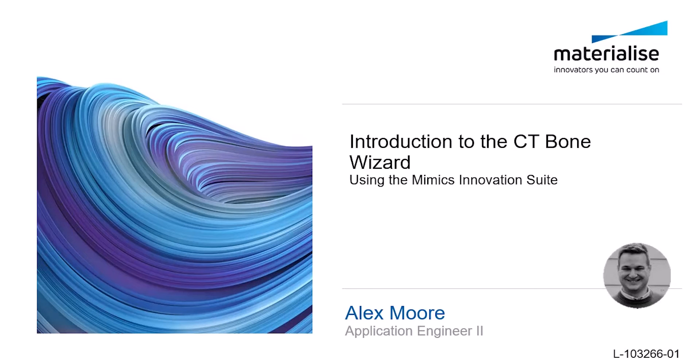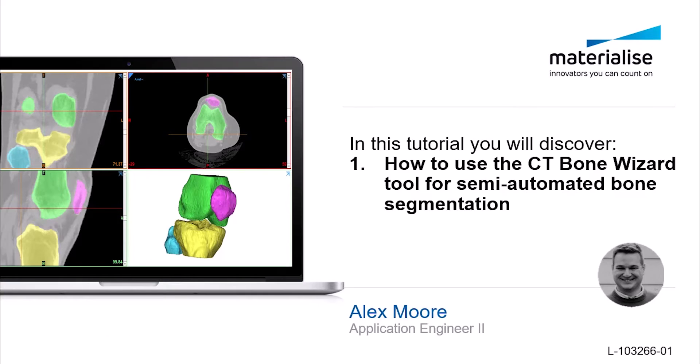Hi, my name is Alex Moore, and I'm an application engineer at Materialize. In this video, I'm going to show you how to use the CT Bone Wizard tool within Mimix.